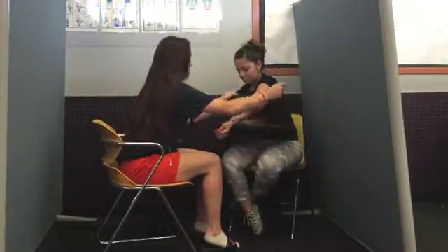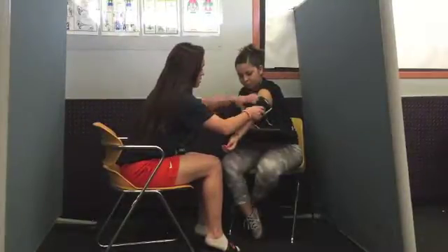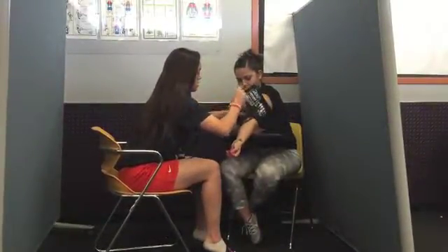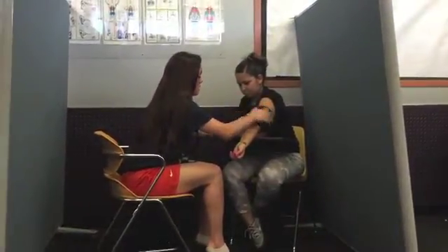Once you've found the proper cuff size, you want to wrap the cuff firmly around the upper arm at heart level. Align the cuff with the brachial artery. Most of them say it on there. And make sure the cuff is tight.